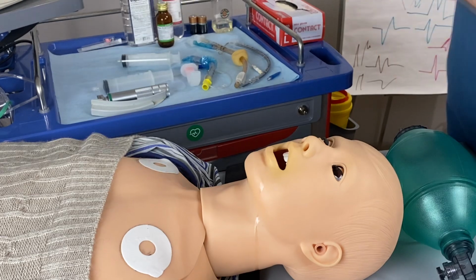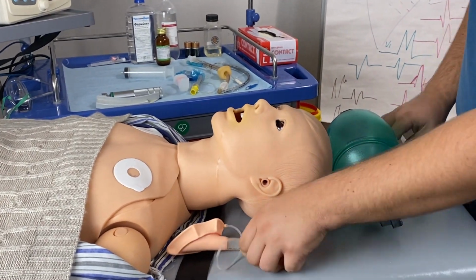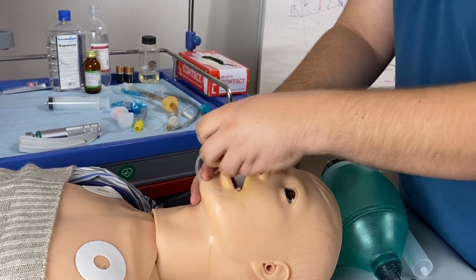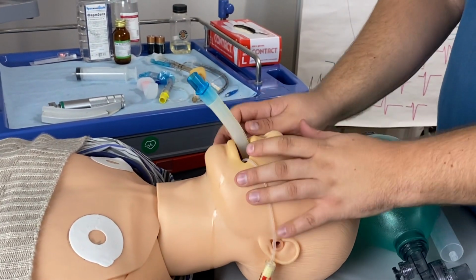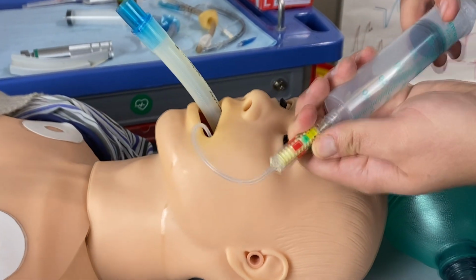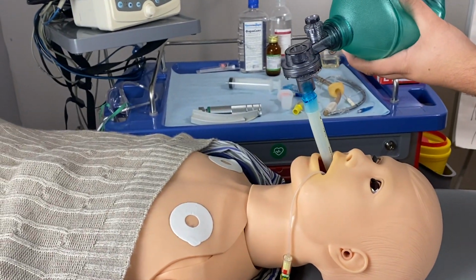Now about the laryngeal mask. As I've said before, we firstly have to remove all the air, or it will not fit. Then open the mouth and get it as deep as possible inside the patient. If the patient's mouth is small, you may damage the cuff with the patient's teeth, so try to avoid that. When we're inside, we use this specially designed cuff to get it into the green area, and also we can attach the bag and ventilate.